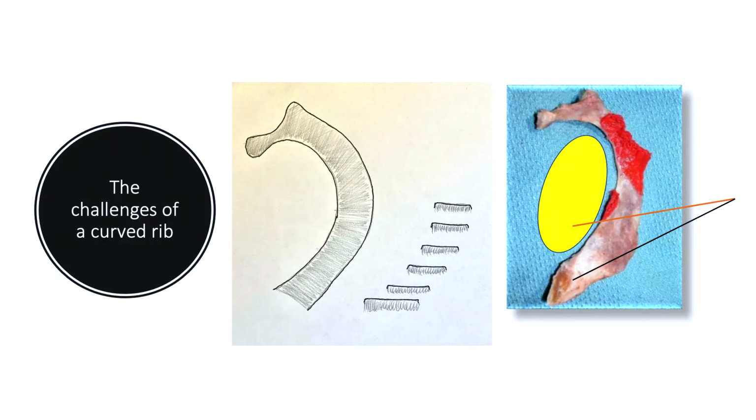The needle is still, and you see movement in the image, transmitted movement, but you don't see the actual needle. And unfortunately, people take that as being the needle. Then all of a sudden, the needle appears and surprises you in a position that you didn't think it was, judging just by the movement of the image. So you know that you cannot trust that you will continue to have contact with the needle at all times. So you have to come up with another solution.